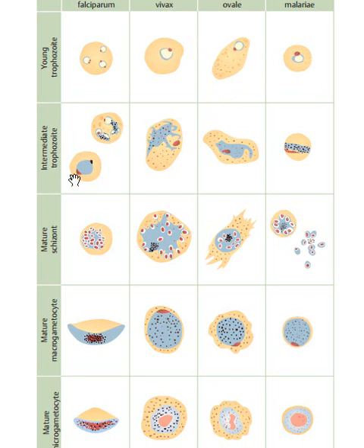Now the next diagram here is in the case of the intermediate stage of trophozoites, or the mature stage of trophozoites. So here you visualize that there are trophozoites seen as such. So the diagram is seen as such. Here this is how the trophozoites are going to be spaced out. Here in ovale it is going to be spaced out like that, and malariae is going to be spaced out like that.